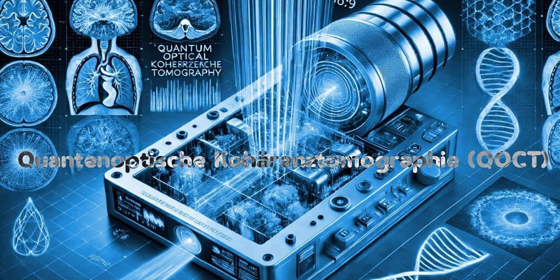Standard wave interference. But QOCT swaps out that normal light for pairs of entangled photons. Exactly. And that quantum switch gives you potentially much better depth resolution. You can see finer details, deeper inside materials or tissues. Okay, better detail, deeper, and better signal to noise, too. And dramatically improved signal to noise ratios, yeah, which is crucial. So less static, more actual image? You got it. Less fuzz, more clarity, deeper down.